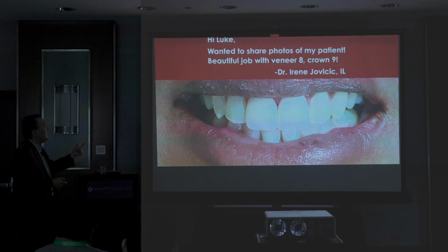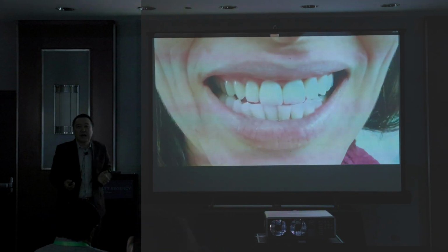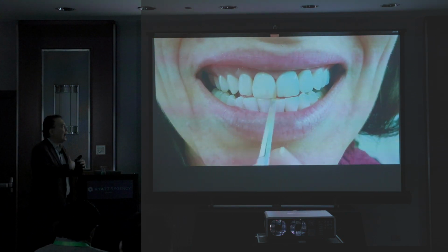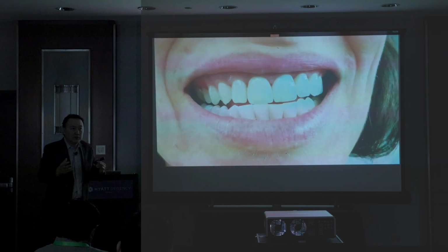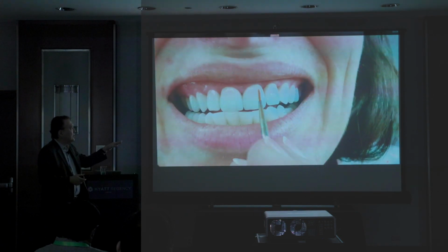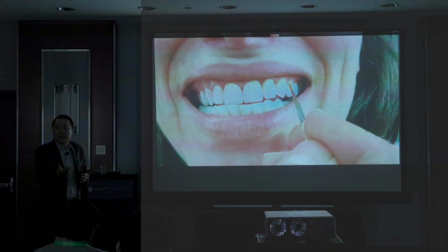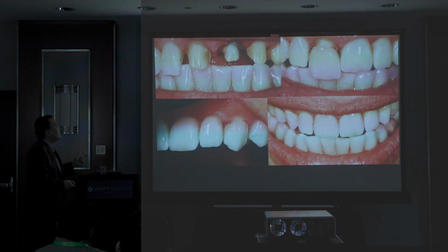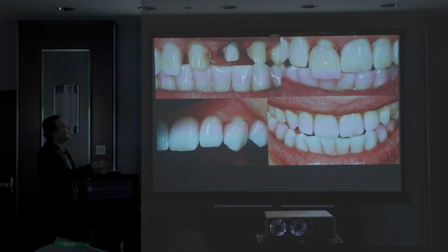So I got the letter from her. So this is a veneer, what I'm looking for. The same thing with the patient, we don't know sometimes, right? Which is most of the times. The problem is whoever pays more money, they require more. So my job, I have to figure out exactly what they want. Sometimes they say, I don't know, I want natural, but I'm trying to figure out the external staining compared to Jason's teeth. I'm trying to match it up. Right? So people ask me how can I take it out? I can show you later a little trick, but sometimes I fail. Anyway, for 4 crowns, I have to do the painting, then this is a photograph, and then I can see the difference. The prep, the white, good dentine, then I can follow exactly what kind of shape and contour, and then put it into the patient's mouth.